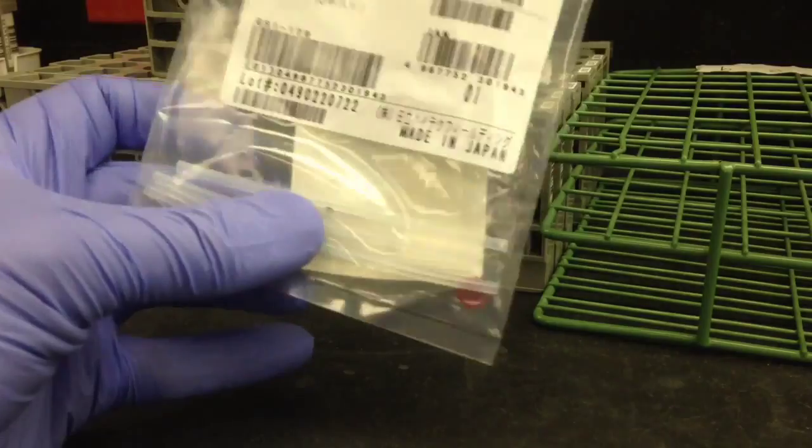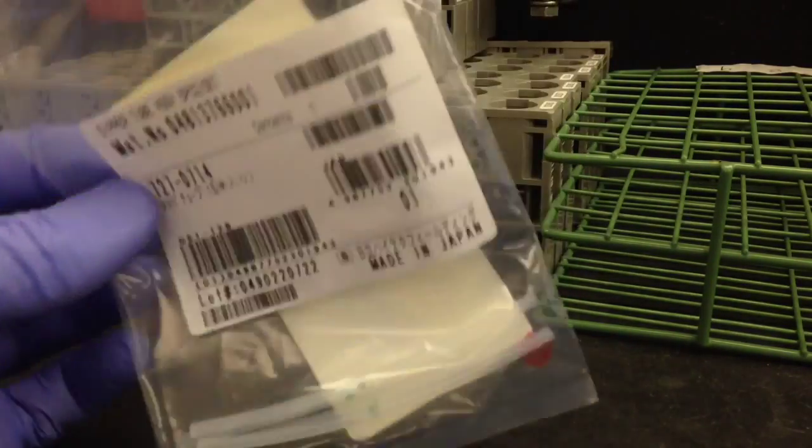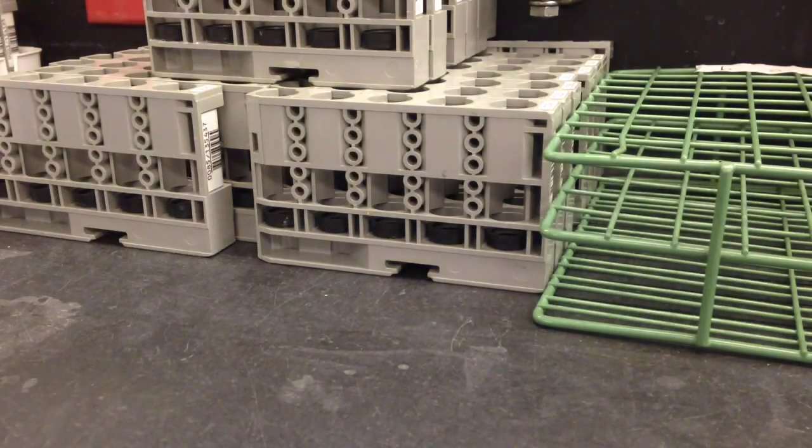For this maintenance, all you're going to need is the tubing itself. Here you can see I've got it right here, sipper tube. You're only going to need one of those. It comes in packs of five.